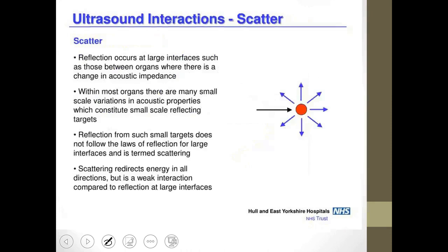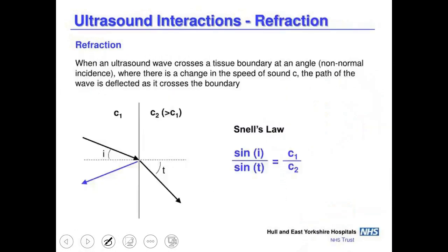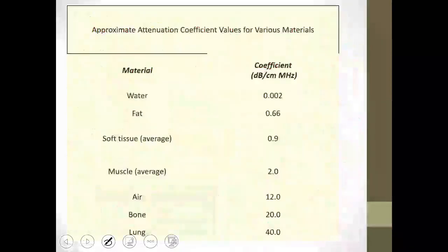We mentioned, of course, that I also have other types of interactions besides reflection. I said that if I have, for example, things like hepatocytes, or the cells that are in the patient, their size is smaller than the wavelength of the ultrasound. In this case, isotropic scattering occurs, which is responsible for the echo textures of the liver in ultrasound. We talked about this in detail.